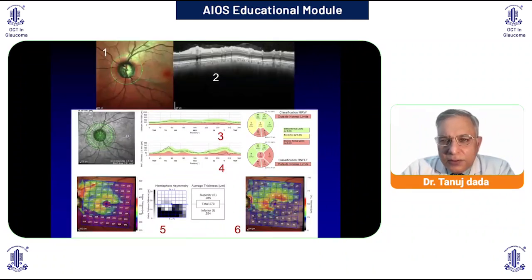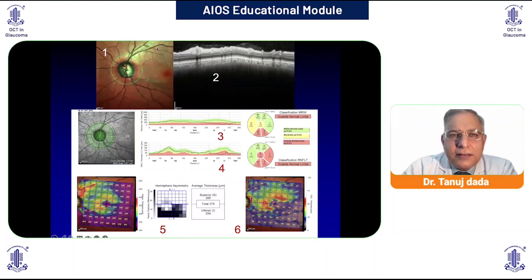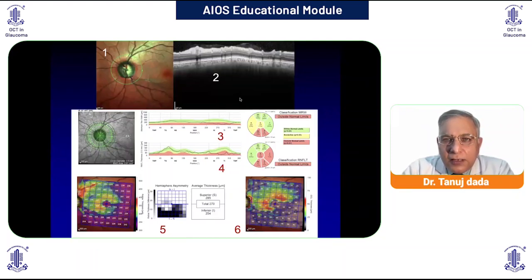So just to go through it again in a different case, number one, the fundus image is well centered, and here already compare superior versus inferior. You can see a dark band. So there is an inferior retinal nerve fiber layer defect. The topography shows that the RNFL boundary is correctly identified. Neuroretinal rim, you can see that there is a thinning of the temporal inferior neuroretinal rim, with corresponding thinning of the retinal nerve fiber layer inferotemporally. You can see the superior RNFL is normal.